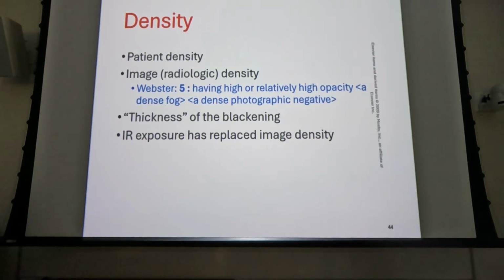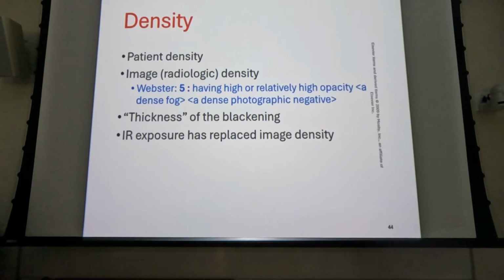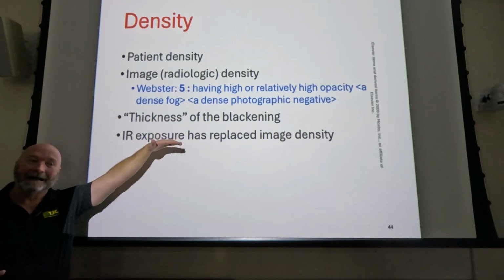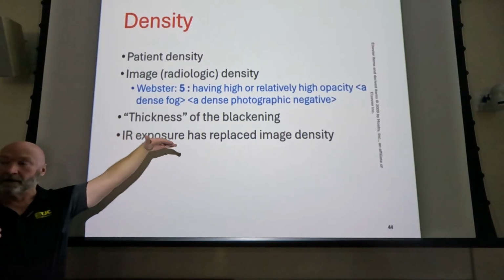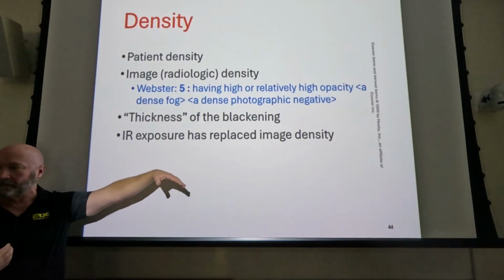It's a very subtractive pathology, and it's going to adjust your overall density, and it's going to adjust your contrast. It's going to come out potentially a bad image. So the area that got the direct exposure is going to be very dark, right? That's high density, very high density. So where you've got the lungs, a chest x-ray, that's high density. Mediastinum is low density, okay?